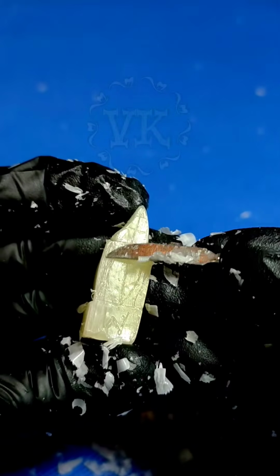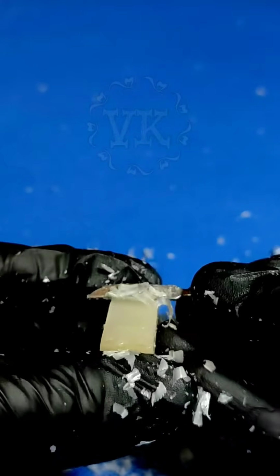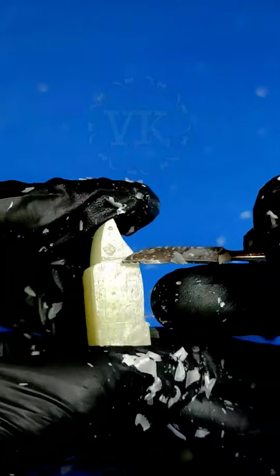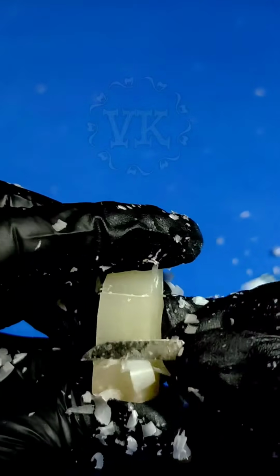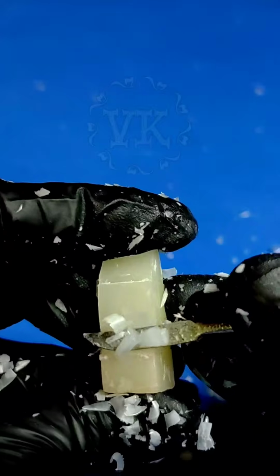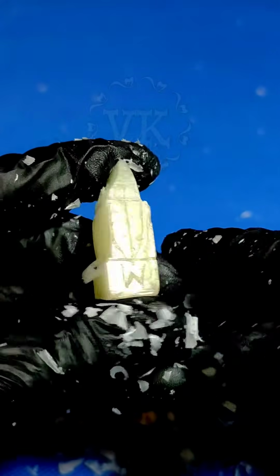So we are trying to reduce this portion of the wax. We are trying to contact the instrument perfectly from one side to another side, so that when you are removing some amount of wax on this side, the same amount of wax is removed from the other side also, and this outline follows the outline that you have made on this side. See how I'm trying to remove.